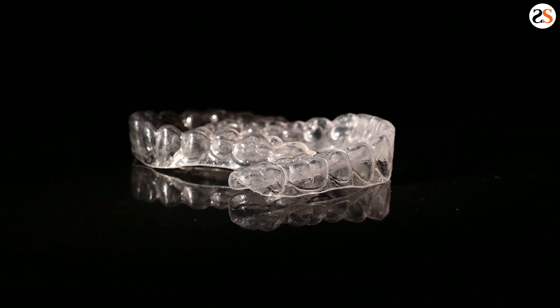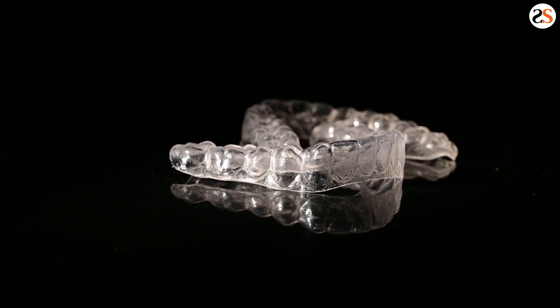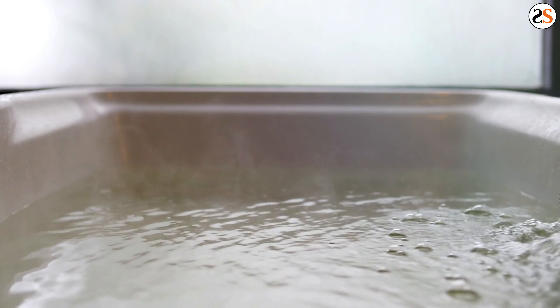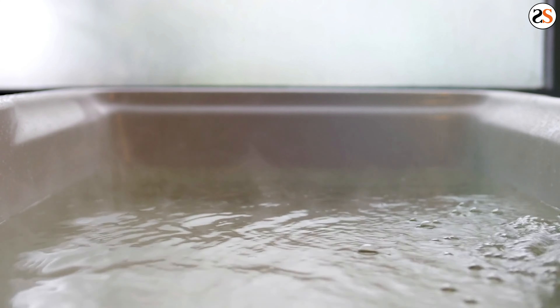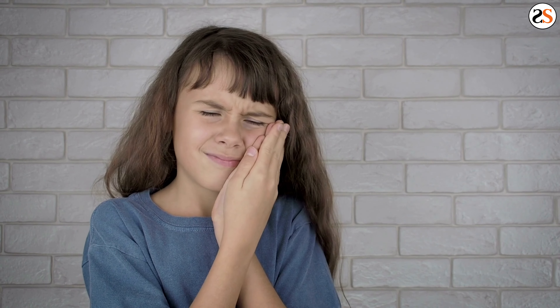Another cause of pain while wearing a retainer is damage. This can occur in a variety of different ways. In many cases, changes in the clear plastic retainer shape can occur when you wash the retainer in hot water. Hot water causes the material to relax and change shape. When this occurs, your retainer may not fit correctly and can place abnormal pressure on the teeth, resulting in pain.